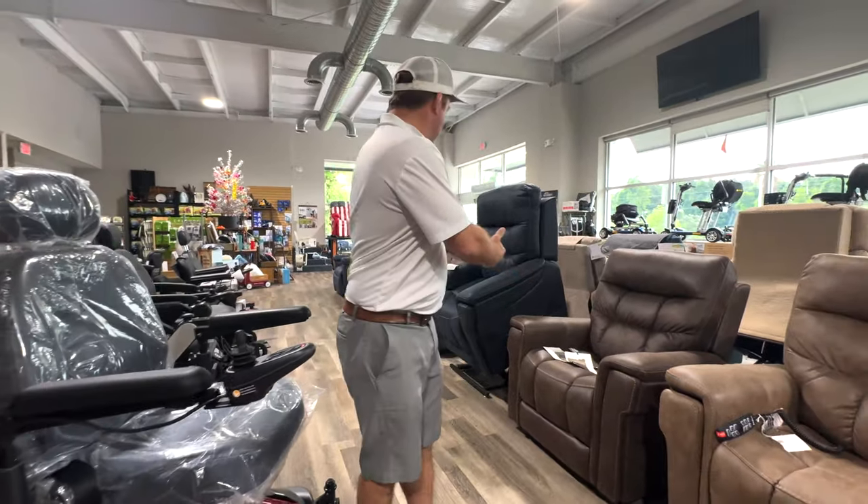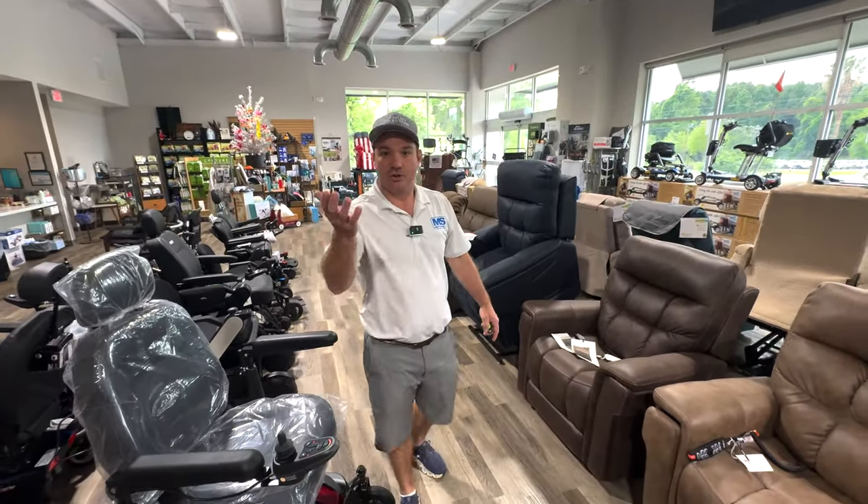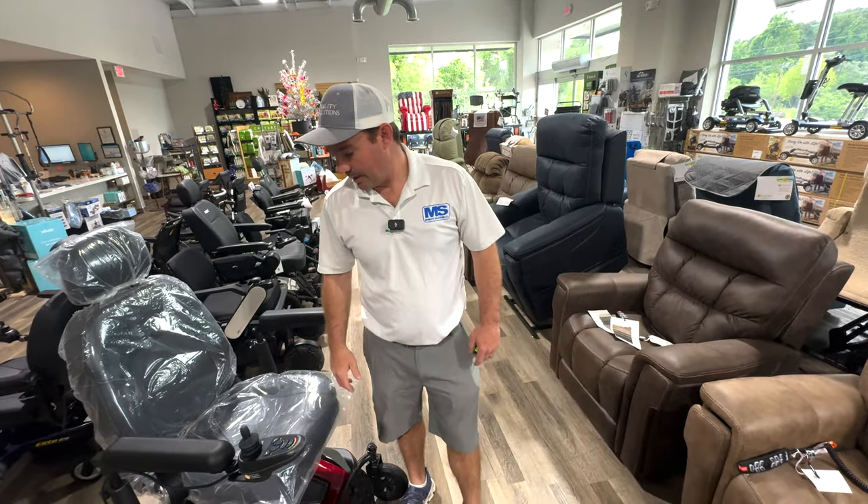It's kind of like a lift chair with straight-up lifting capabilities.